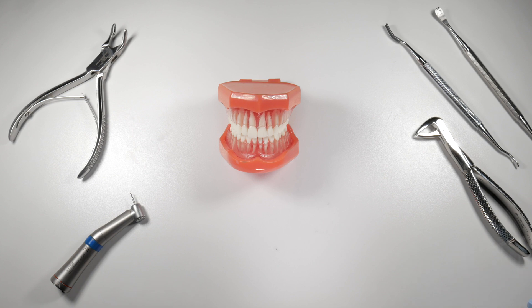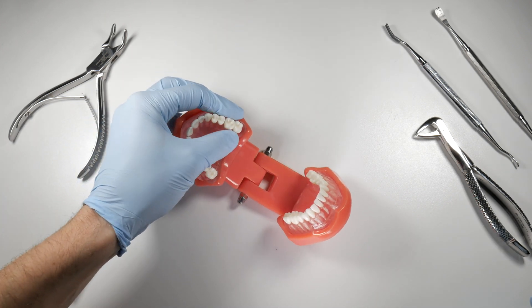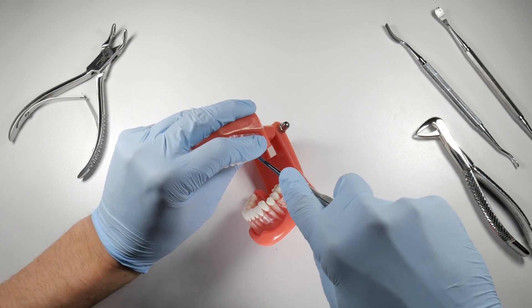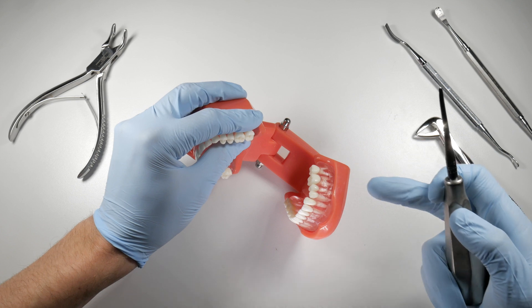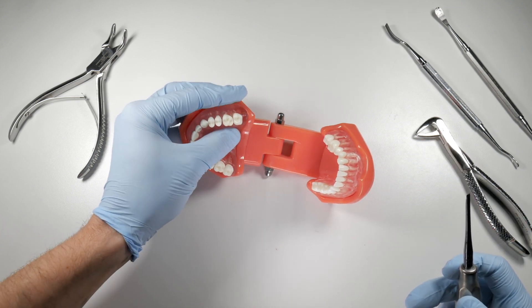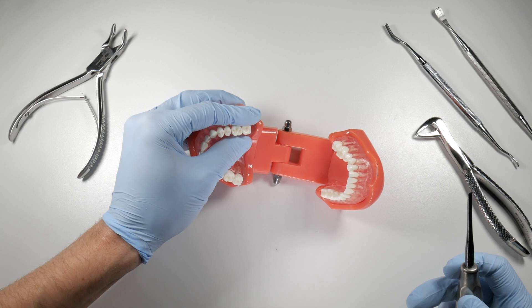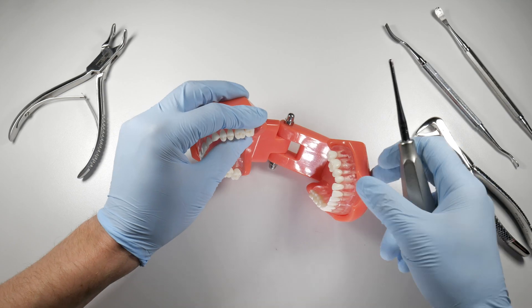Finally, every time you're extracting a tooth, maintain digital sensation and tactile feedback of what's happening. Feel around the tooth and make sure you're not applying too much pressure on the buccal bone — you'll feel it moving and bending. Also apply some supporting pressure there to brace it. If you have thin bone and your finger is acting to support it, you may experience fewer fractures by providing that additional stability.